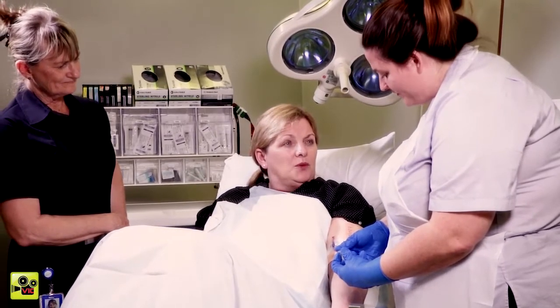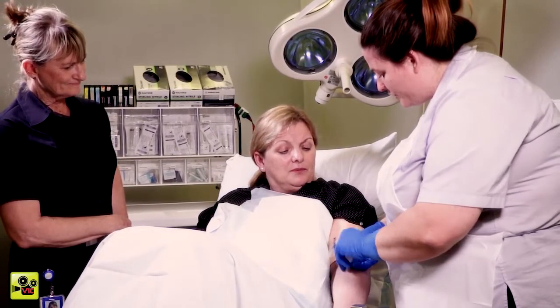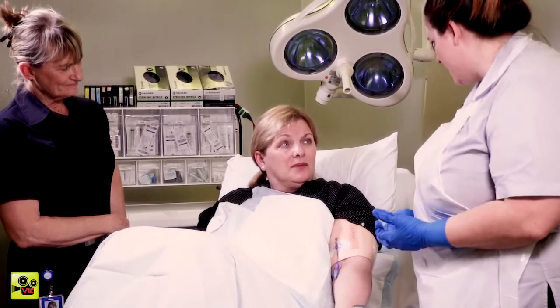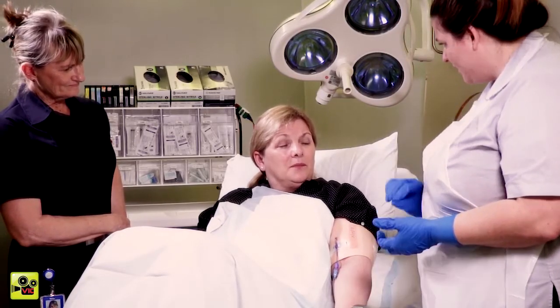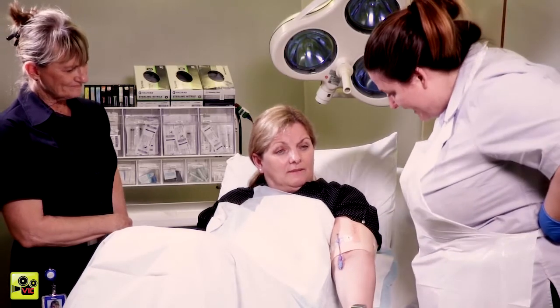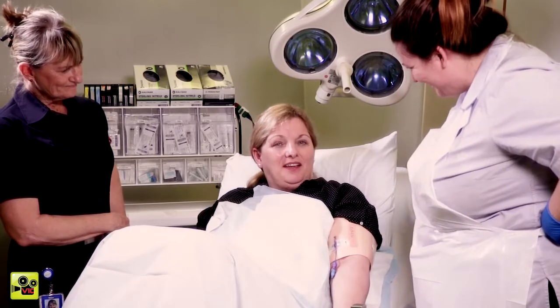Why do you stop and start with a flush? We do a pulsatile motion to try and stop anything from sticking to the line, so it's to get rid of blood or drugs that might have gone through there prior, just to make sure that it's all gone up the lumen so it doesn't get blocked up. But that's everything done now. Great. Thank you. Oh, good. That was a really good job, Jane.